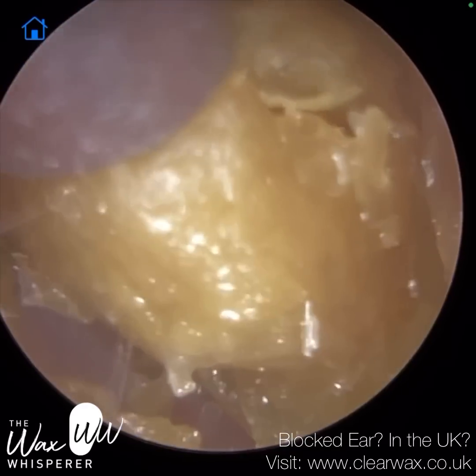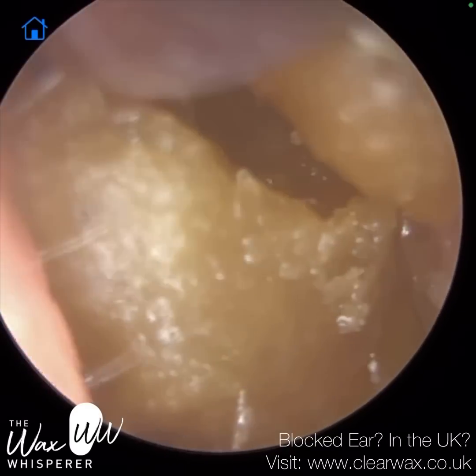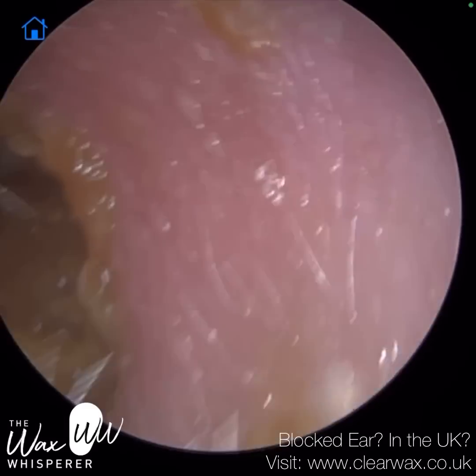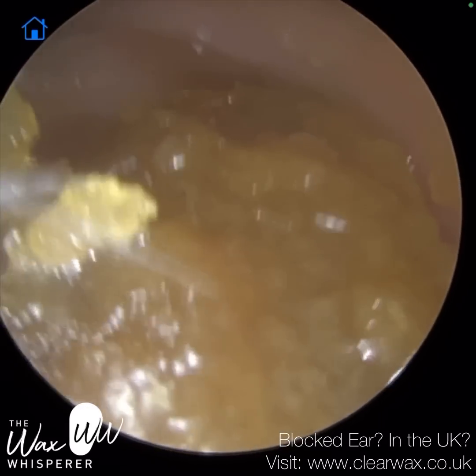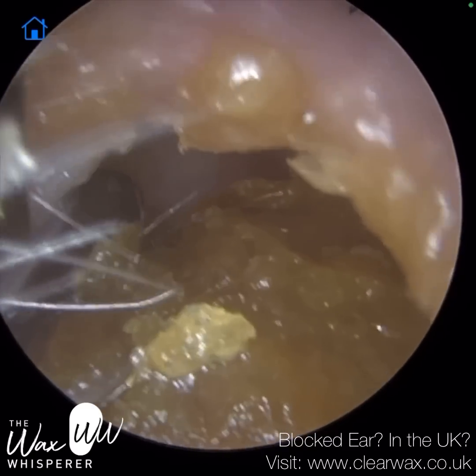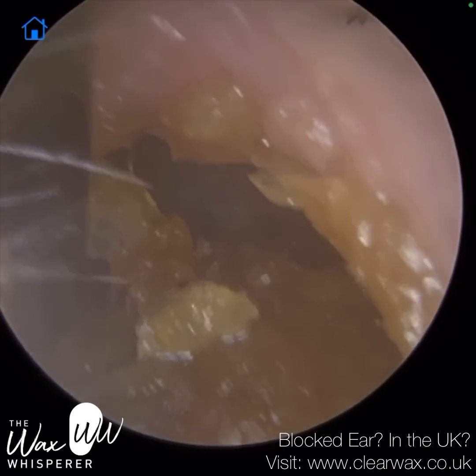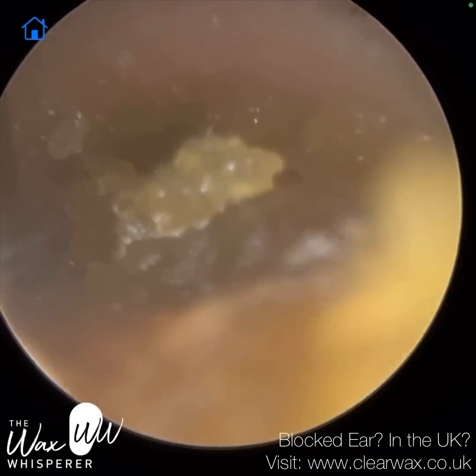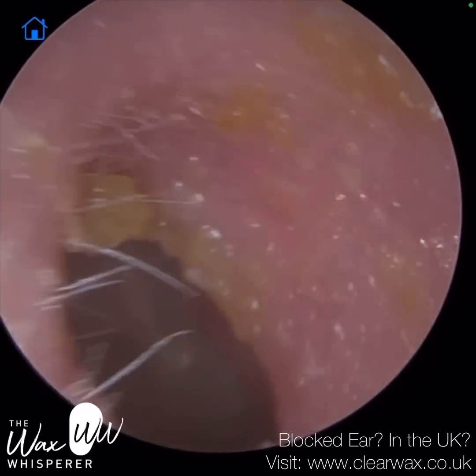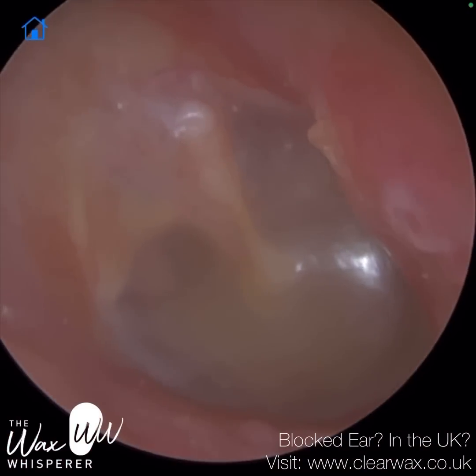I'm just trying to tease this through. Because it was quite a dry piece, it was rough on the surface, so as we're pulling it through the patient can slightly feel it — that's why I put some oil in just to soften the surface. There's a gap at the top of the wax plug. This patient's ear canal is very, very narrow, so I have to stretch the ear open with the endoscope just to get the ear hook into the ear. This is where the wax scope will probably be quite useful — you don't have to use the endoscope to stretch the ear; you use the wax scope speculum instead.